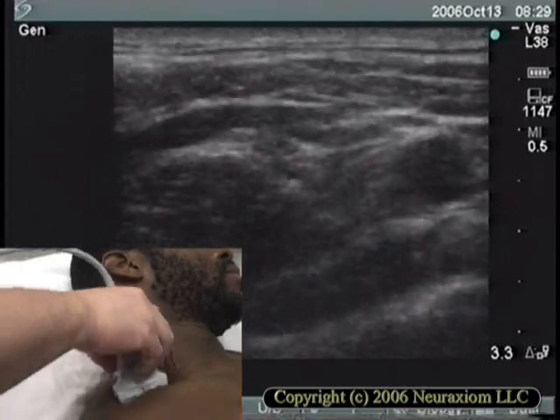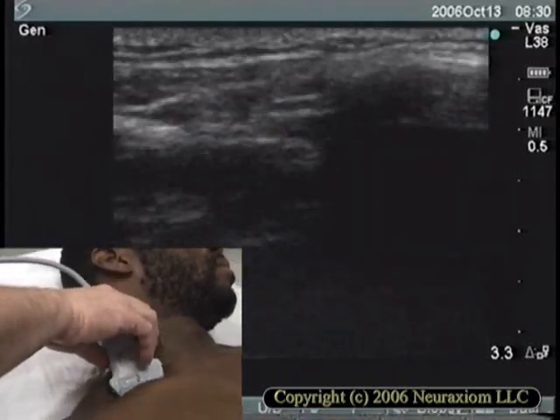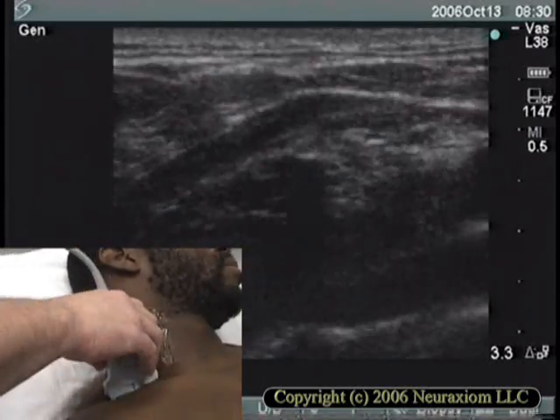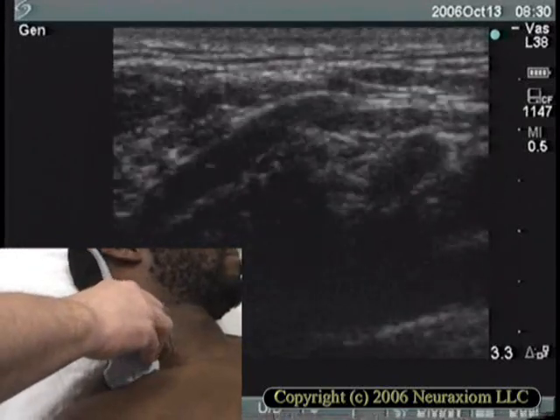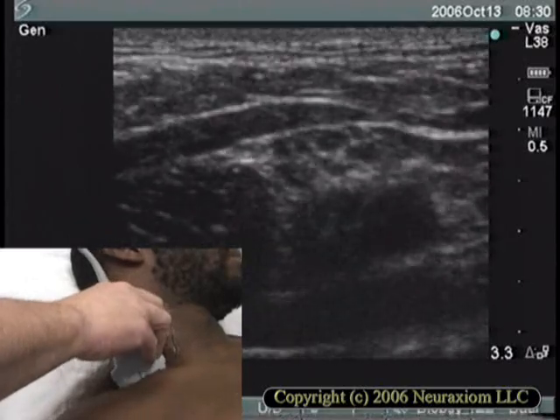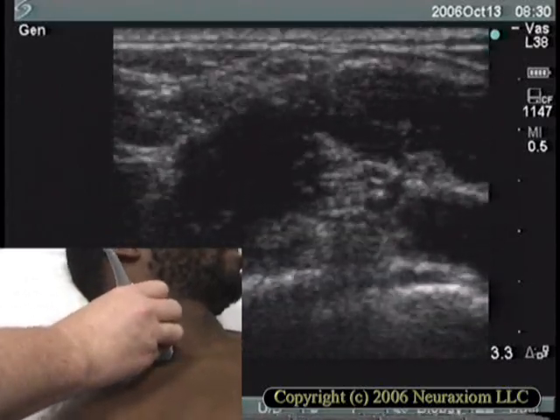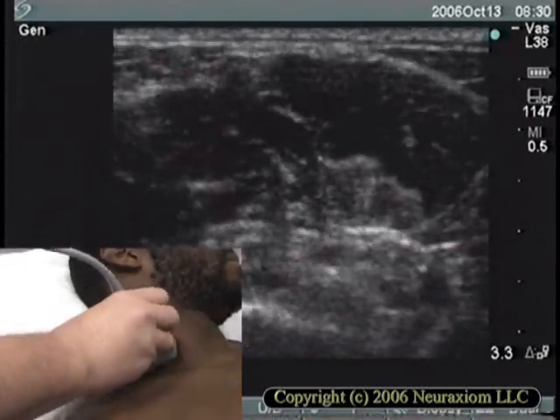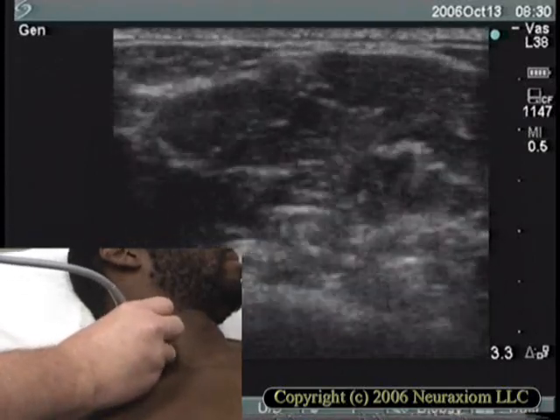Remember that the ultrasound images you're trying to create are based on reflections, and those reflections are greatly influenced by the angle of incidence to structures. So if you're not seeing what you think you should be seeing for the probe's position, try changing the angle of the probe to the body surface or rotating it slightly clockwise or counterclockwise. Also remember to keep the gain on the instrument turned low enough to give you some dark in the background picture — you'll find more structures with the gain down than up.